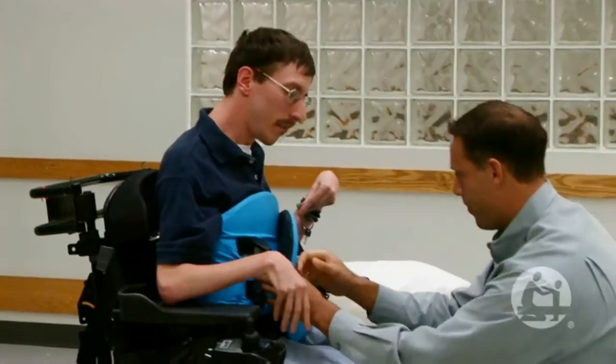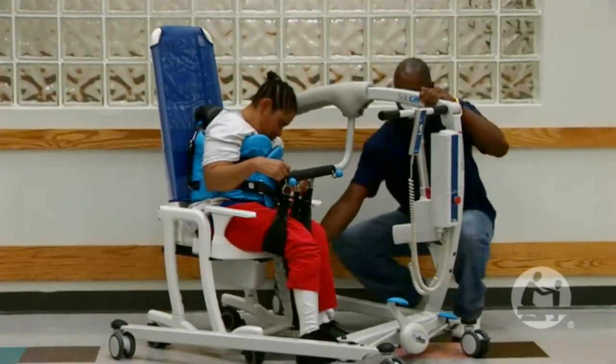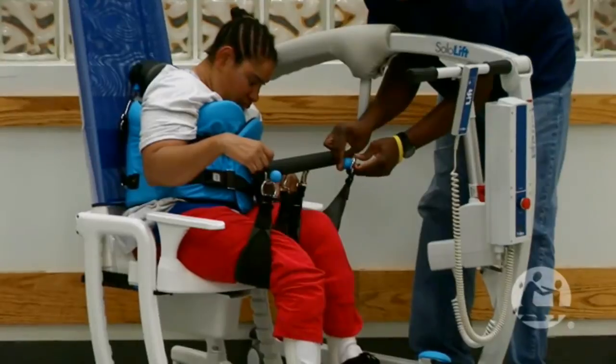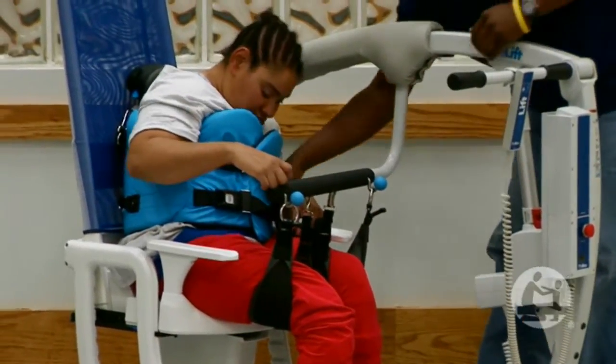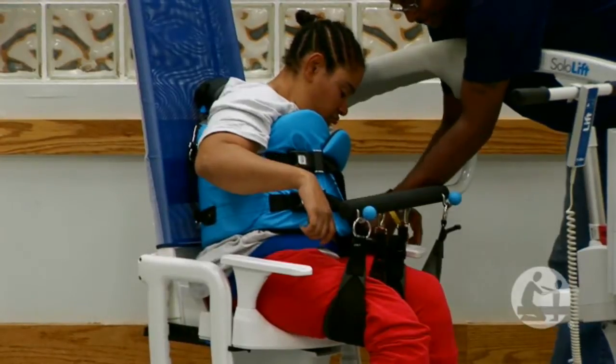One aspect where I have noticed that it could provide significantly to the dignity of people served is in their personal care needs — when one staff member can assist as opposed to three. When they're able to be supported using a commode chair or a toilet, staff are able to step out. There's a greater area in which to help them with the changing of clothes or diaper change that hasn't been available with any of the other lifts.